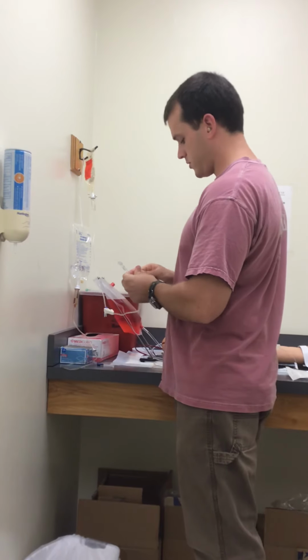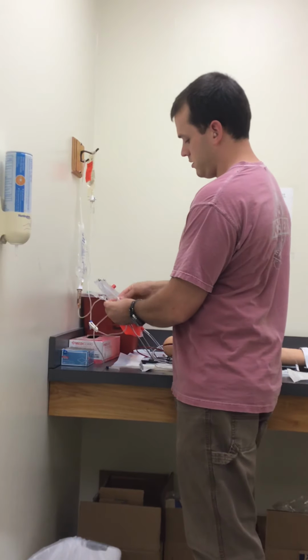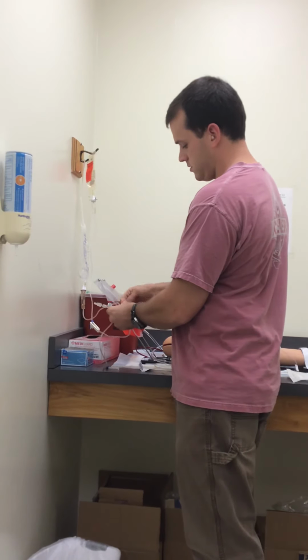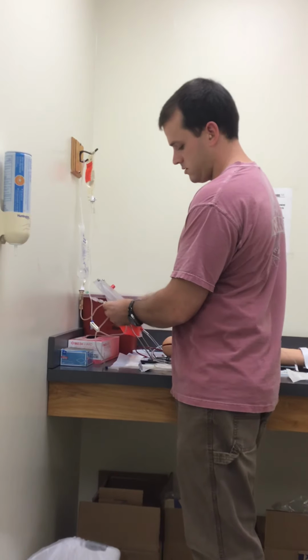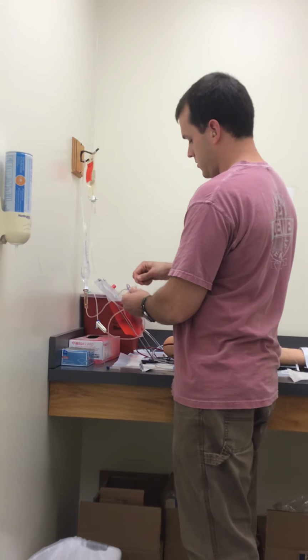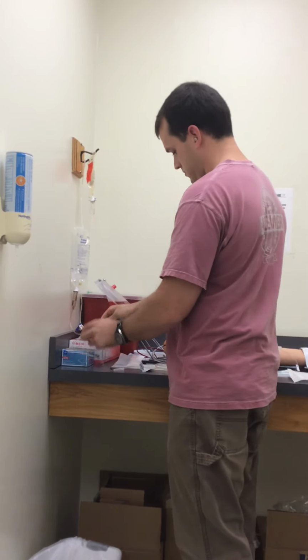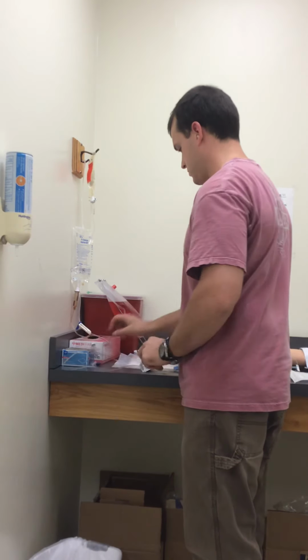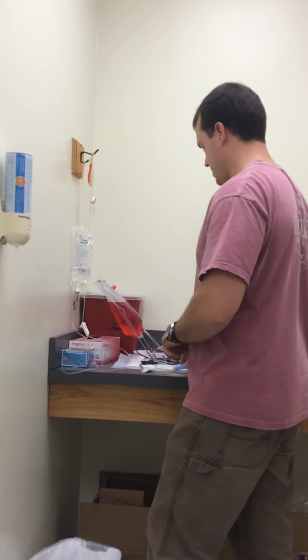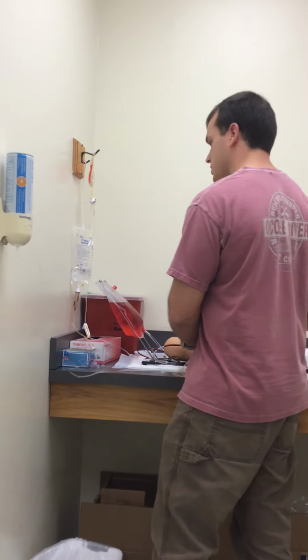Got my alcohol pad that I brought to the patient's room. I'm going to use the hub closest to my primary infusion bag. Scrub it for 15 seconds. Cap off my secondary. Alright, unclamp secondary tubing. Now I'm going to set the rate using my primary line. Might take me just a second.